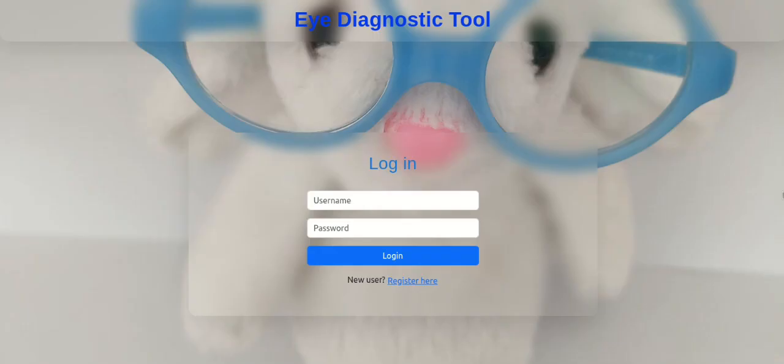This is a supportive eye screening and assessment tool aimed for parents and clinicians to be able to identify potential warning signs that can affect children's vision development, as early intervention is extremely important. That application was developed by using Django and React frameworks.